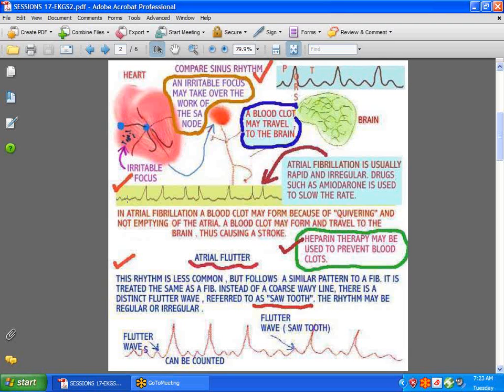In atrial fibrillation, there is no P wave, which means the atria did not contract. What we have in essence is a coarse, wavy line followed by a QRS — coarse wavy line, QRS, coarse wavy line — and it's very irregular.